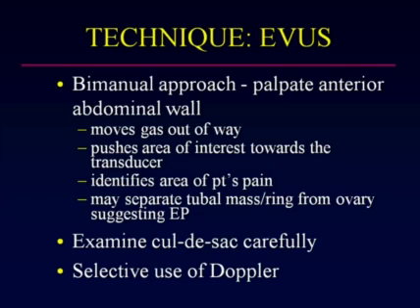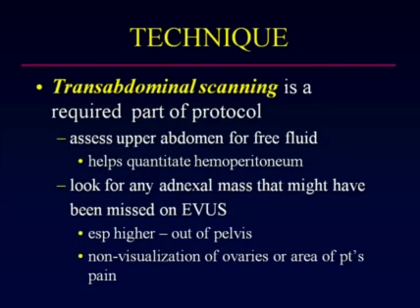And you want to use Doppler selectively in the first trimester as a last resort for evaluating the adnexa and occasionally the endometrial stripe. Now, while we focus our exam on the endovaginal component, transabdominal scanning is a required part of the protocol.